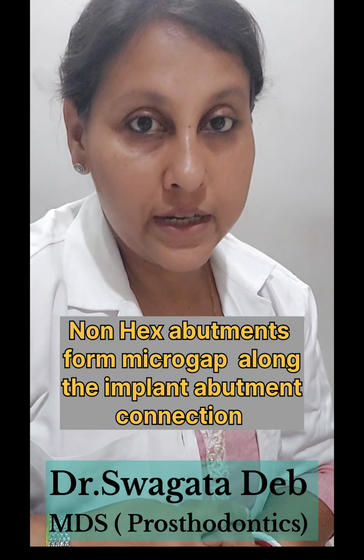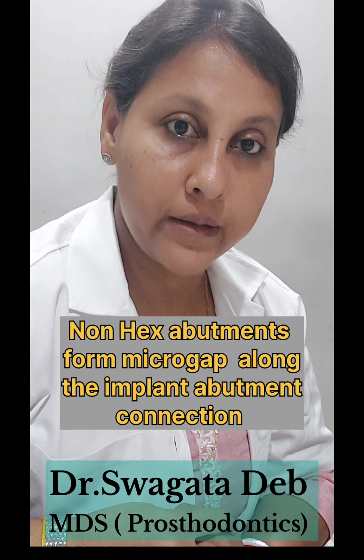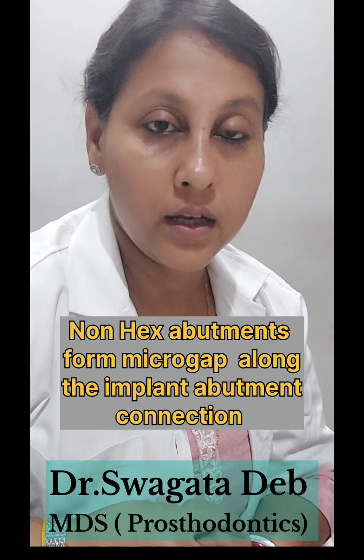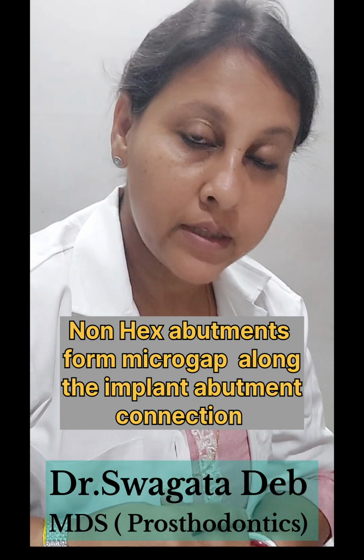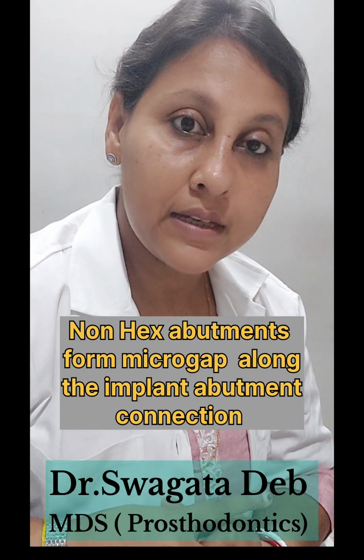If more stress is generated on the prosthesis in the case of non-hexed abutments, this stress is applied along this surface, this microgap formed, and through this gap saliva and bacteria from the oral environment can penetrate. This is a disadvantage, though various other studies have also come up with evidence that this microgap is so minimal that it doesn't affect the implant health.